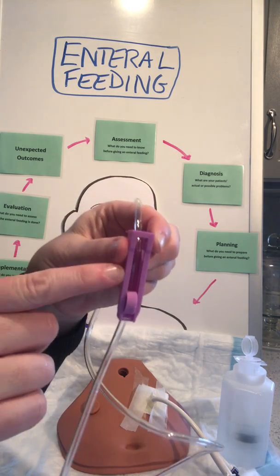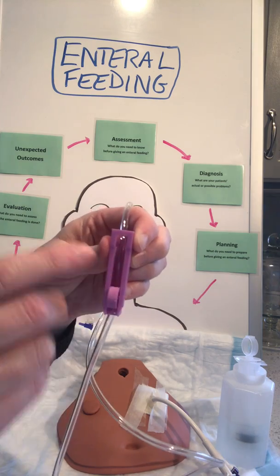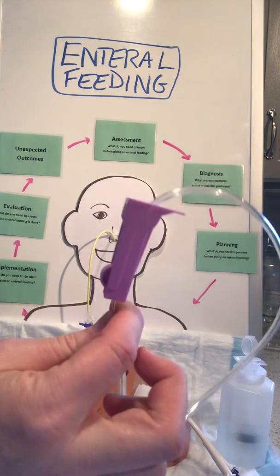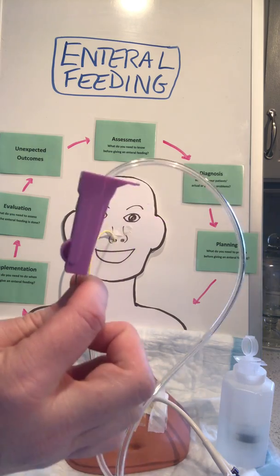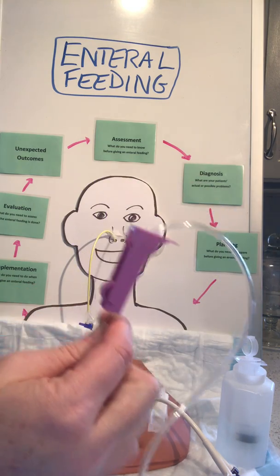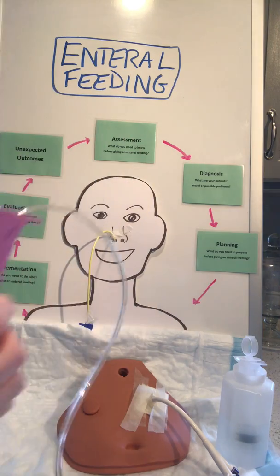This is essentially a pump. This is the old way of doing pumps. Nowadays you'll see in the video and in practice that we use electronic pumps to control the flow of fluids into the patient's body because, number one, it's more accurate and it's safer. And they have alarms that will go off if there's some problem with the infusion. But for us, we're going to be talking about the gravity flow rate.